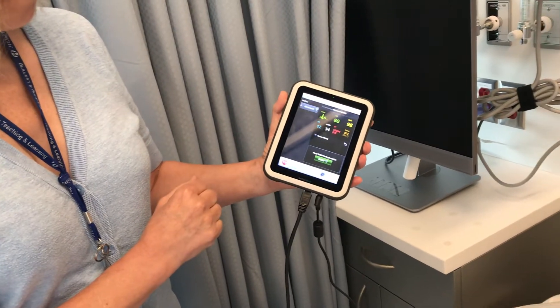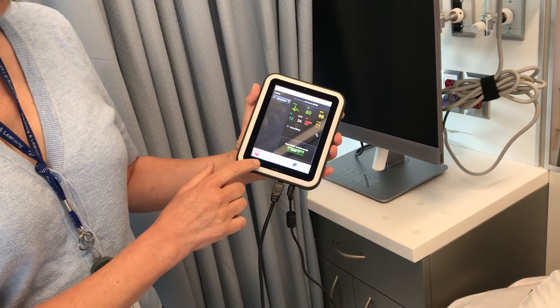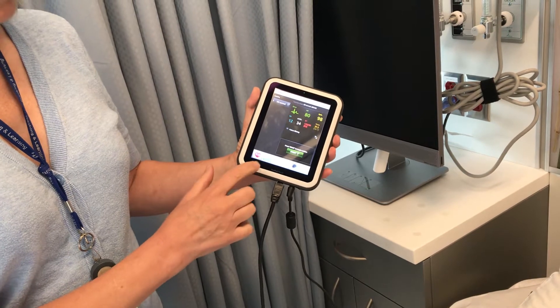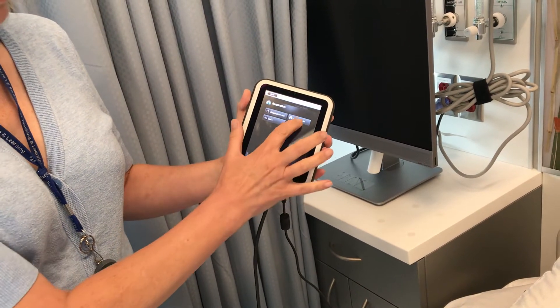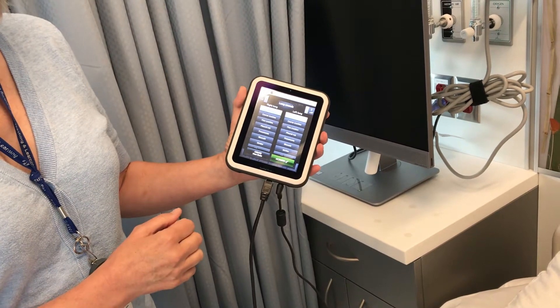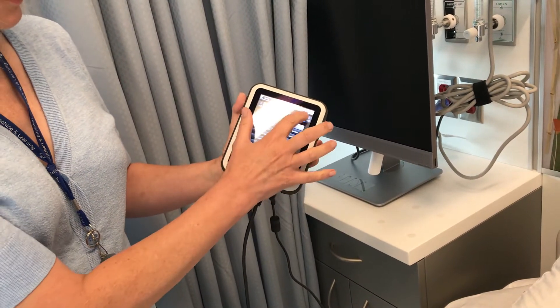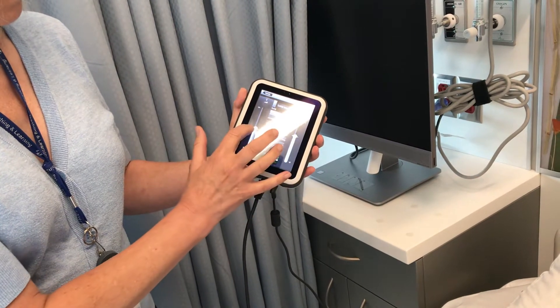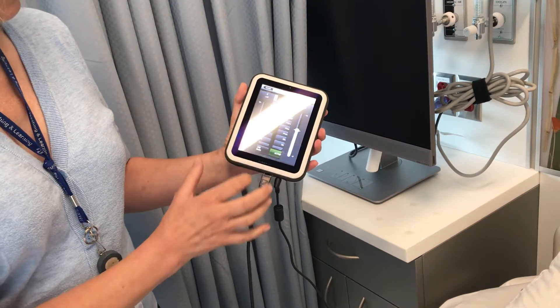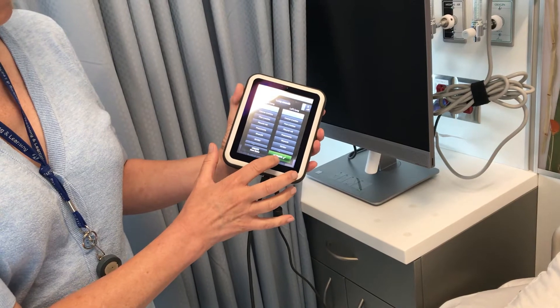I'm going to hit OK. Then I'm going to choose heart, lung, or bowel sounds — I'm going to choose lung sounds. We like to standardize the volume at six, so slide that up and hit activate.